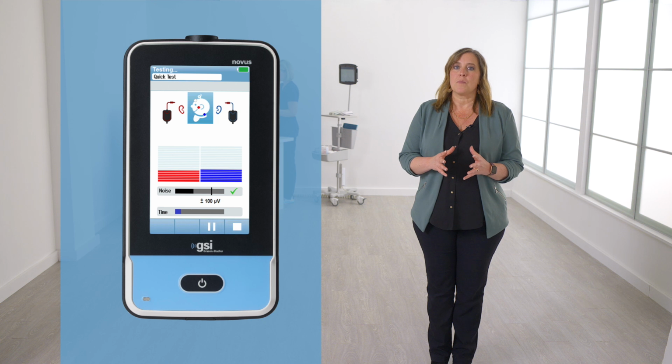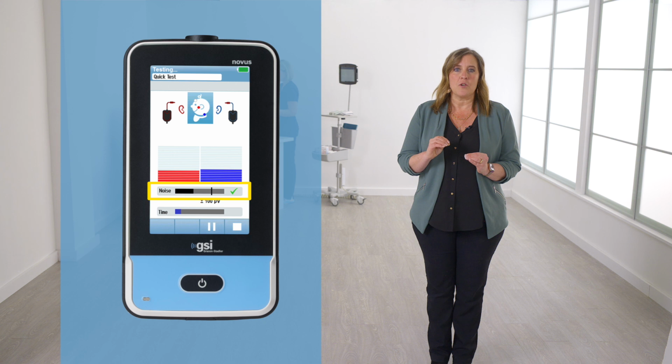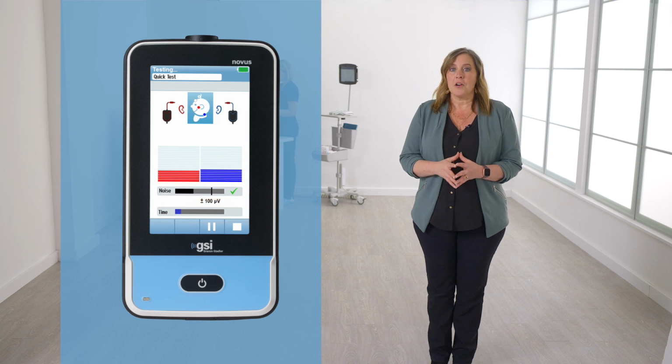Second, there is a noise bar that displays the amount of noise measured during the test. A check mark in the bar indicates that the noise is not interfering with the evaluation. The check mark will disappear when the noise is too high. Third, the time bar is a progress bar to keep track of the test time. The test will last a maximum of 3 minutes.